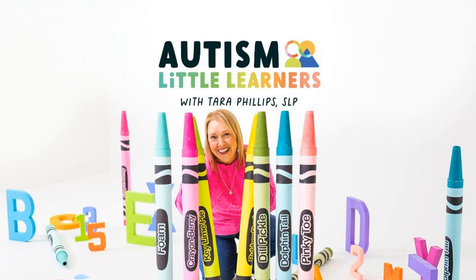Families often ask, how do we use an AAC device outside of school? And the answer is simple: just like speech, through daily routines. So you're going to want to start by modeling throughout the day. Here are some examples. In the morning, you can model oh, look, wake up, or you woke up. Brush, eat, go, ready.